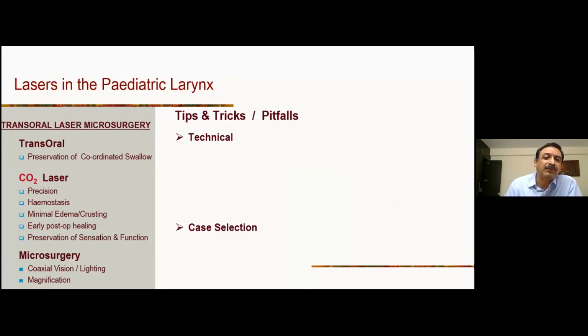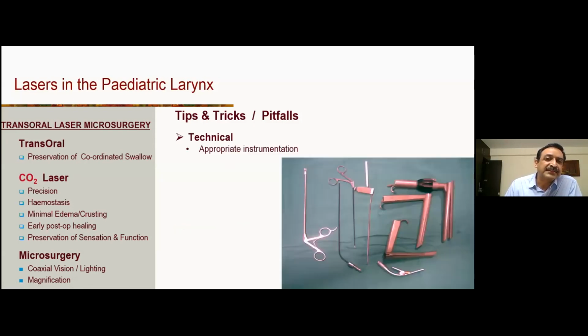Again, the laser's been around for a long, long time. It's been around for more than 50 years. So it's not that these are new out there, but nevertheless, some lessons you learn as you go along. So on the technical side, of course, it's important to have the right instrumentation. You have to have the right scopes, and you should use as big a scope as you can, of course.